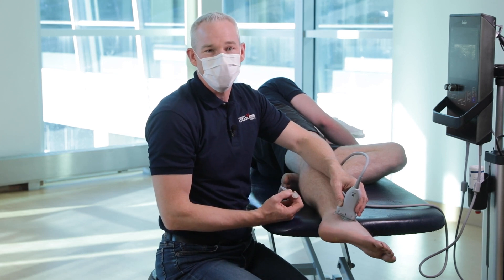And that's how I scan and inject the ATFL of the lateral ankle.